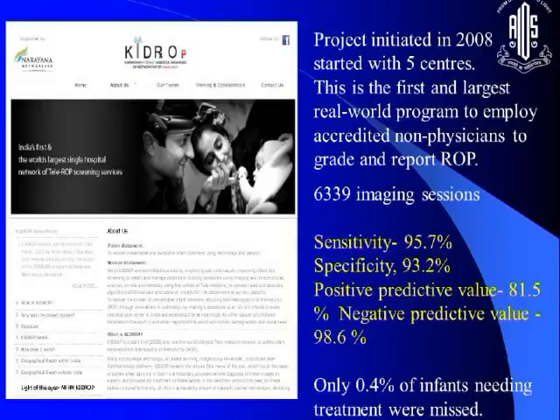Not only that, I would like to mention there's something already in the offering, since this machine is very expensive, where he is involved. I think it is with the Forus, being demonstrated here, which is going to be very cheap. I think you can get like 120 degrees. So we'll have great things coming as far as this modality is concerned. Maybe that is the way that retinopathy of prematurity and, as I said, universal eye screening would be done for infants or children anywhere, which is not possible in our country.